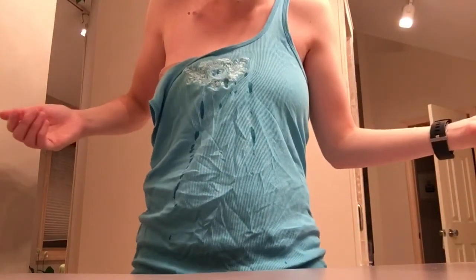So I'm just, whoa, that's soap. It just squirted right out at me. Holy cow. I'm just gonna wash my hands and bring all my sterile things over here. I can't touch my phone, of course, once I am sterile and after I wash my hands.